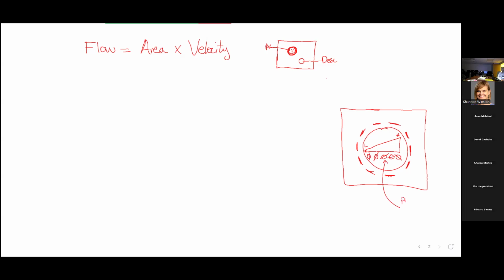The protons accumulate a phase shift proportional to their velocity. Well, that's kind of interesting. So what that means is you can measure speed. So remember, velocity is speed and direction.